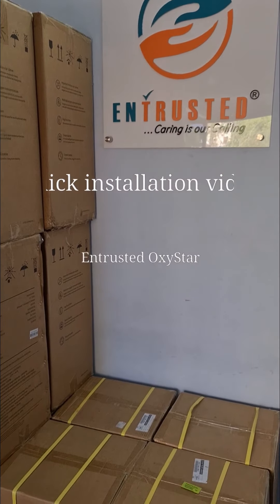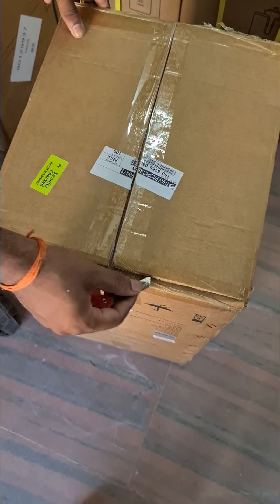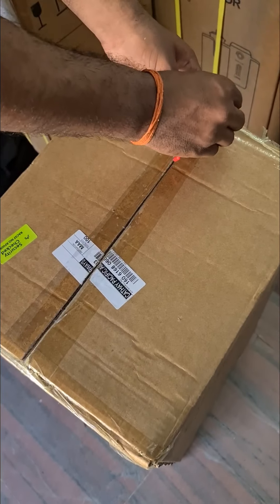A short installation video for all the OxyStar customers. Once you receive the package, open it carefully.